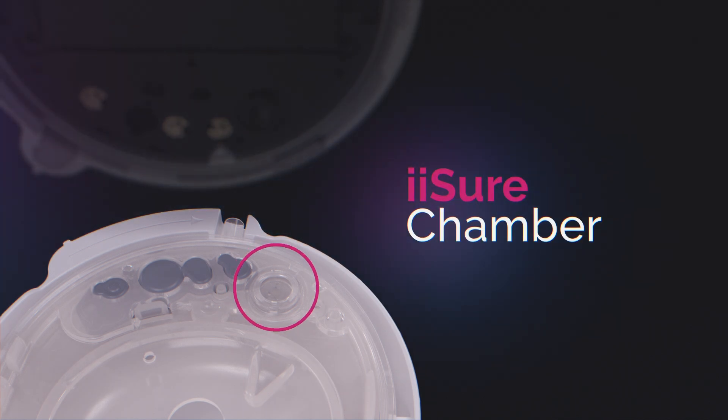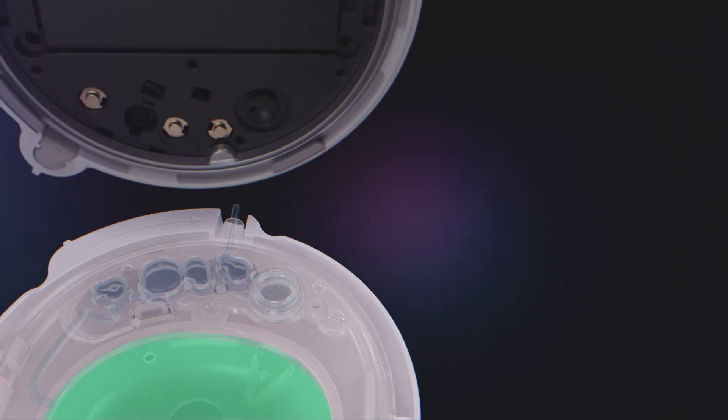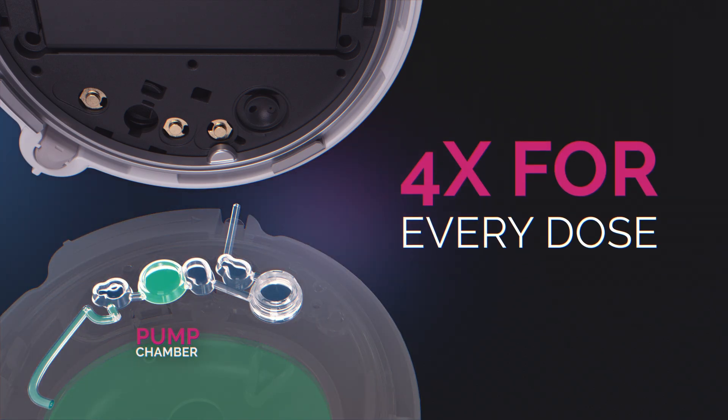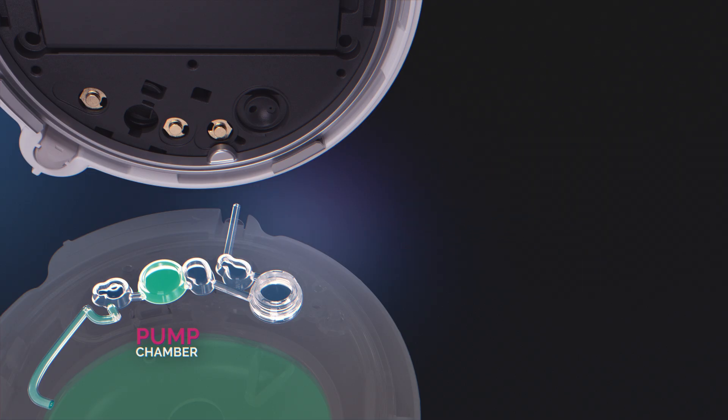Each pulse of insulin enters this chamber before being delivered to the user. As insulin flows through the system, the Twist AID system uses four key checkpoints to validate the precise dose amount. Here's how.